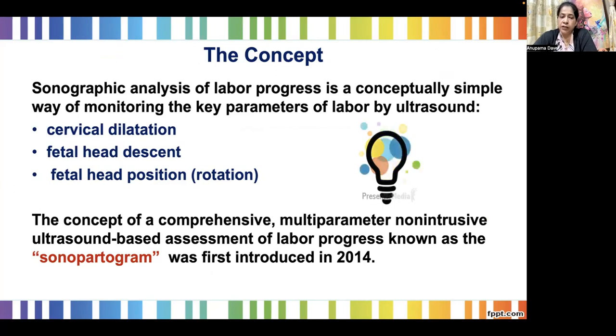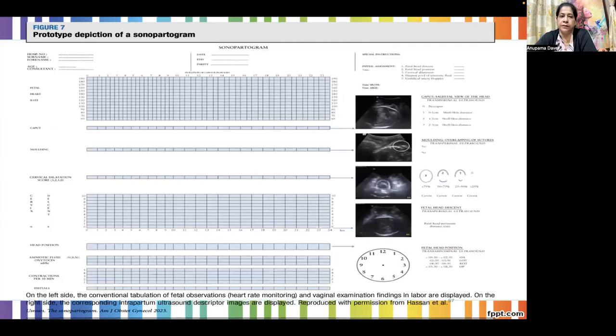If you look at the definition, the concept of comprehensive multi-parameter, non-intrusive ultrasound-based assessment of labor progress is known as the Sonopartogram, and it was first introduced in 2014.